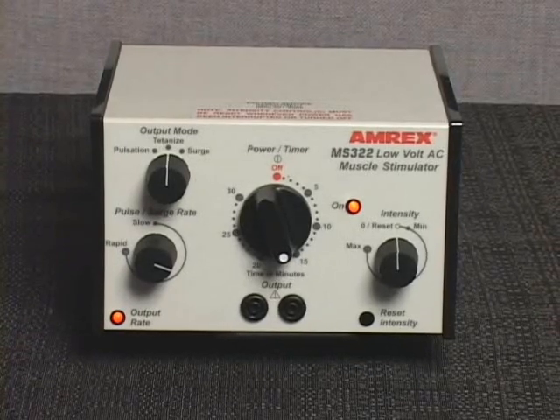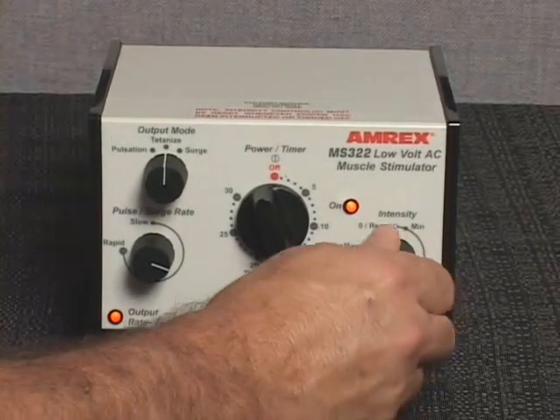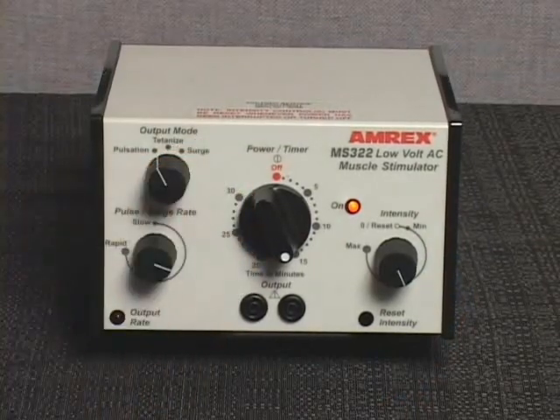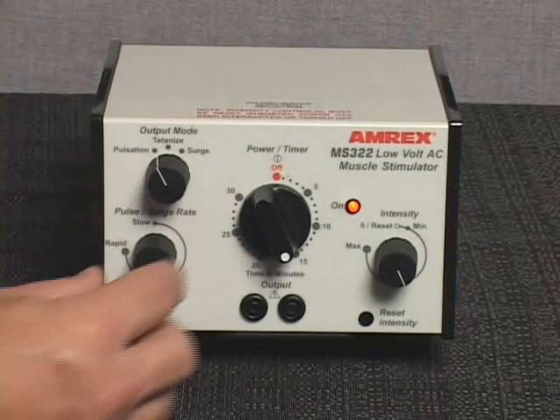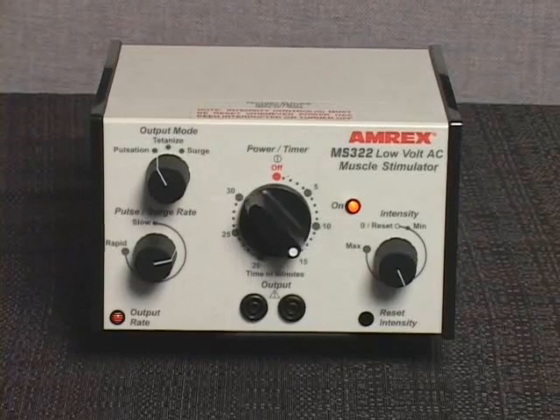Slowly increase the stimulator intensity control to the desired output level or levels. If desired, select an alternate output mode of pulsation or surge and adjust the pulse surge rate control setting. The output rate indicator light or lights will reflect the output rate selected.